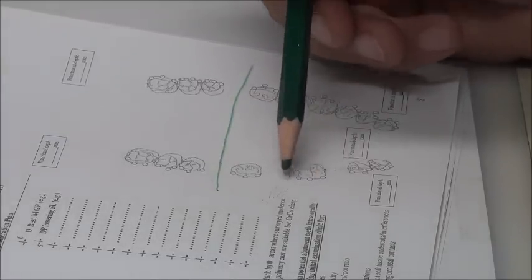Okay? This large stress makes it vulnerable. For biomechanical reasons now, I also reduce the clasping and reciprocation, and I only leave double rests on both sides. Okay? So I have guide plates and rests, guide plates and rests, guide plates and rest, and that's it. Understood? Okay? So I don't need to eliminate the rests because this is a pier abutment.